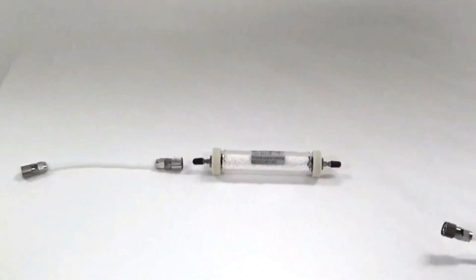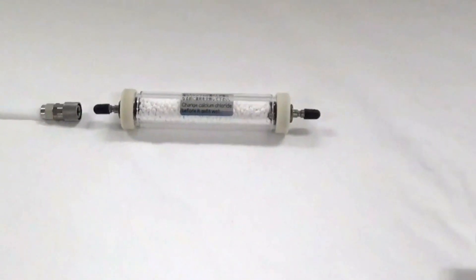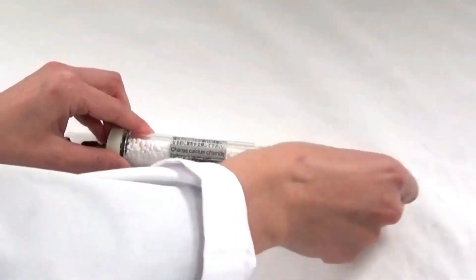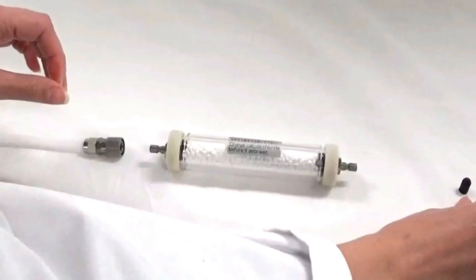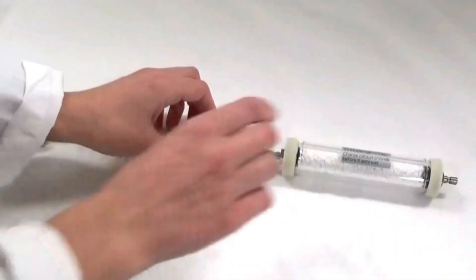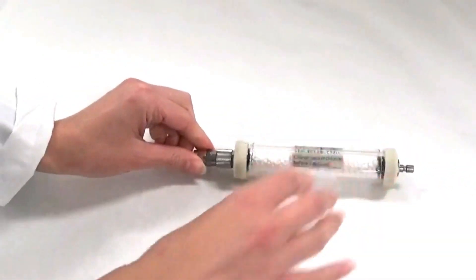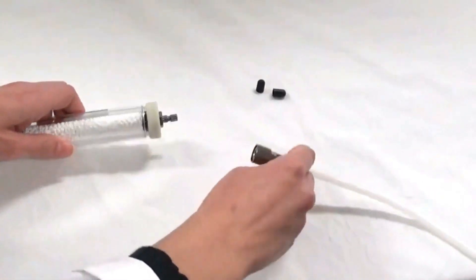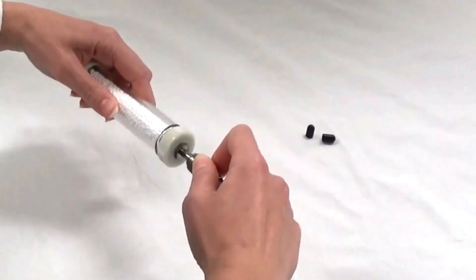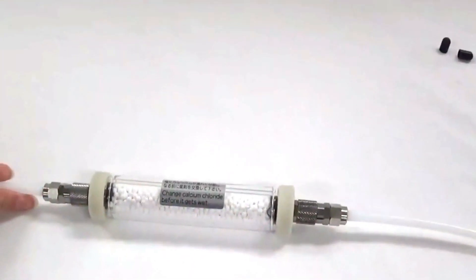Next, we will remove the black protective caps from the calcium chloride filter and attach the 6-inch Teflon tube to one side — make sure it locks — and then attach the 3-foot Teflon tube to the other side, also making sure that it locks into place with the Quick Connects.